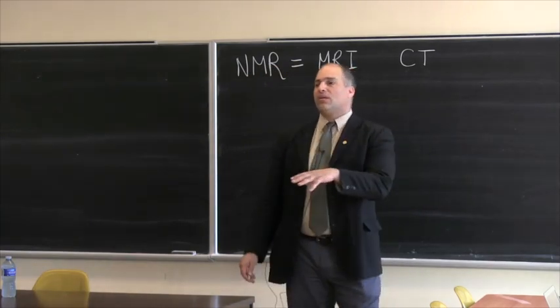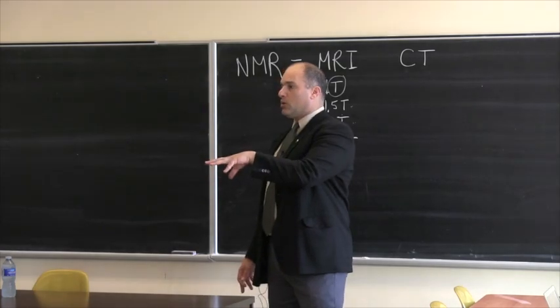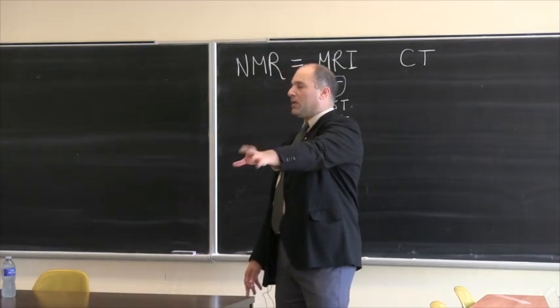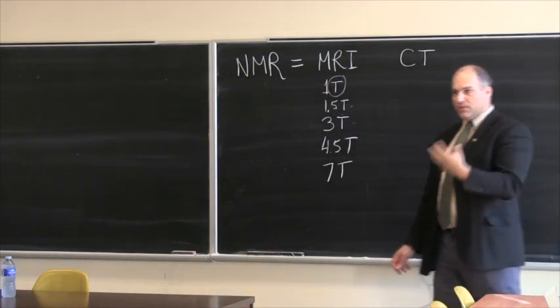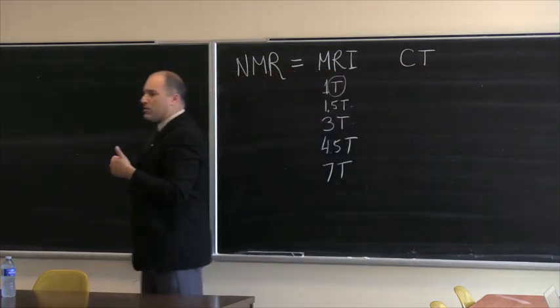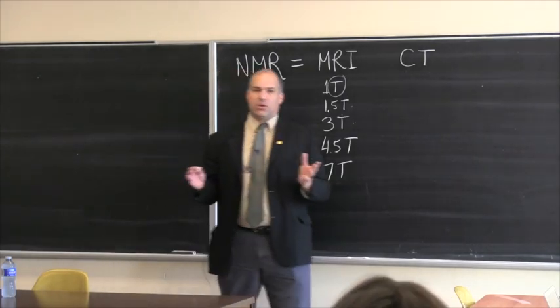And as I would argue later, it also changes the way we think and we solve problems and we look at the world. But I'm getting ahead of myself, so we'll get to that in a little bit. So MRI technology is largely meant for supine individuals, people who are lying down. Not only that they're lying down on their backs, but they're supposed to be stone still. Why? Because the technique is extremely sensitive to motion.